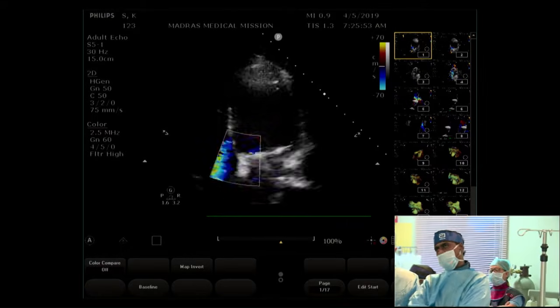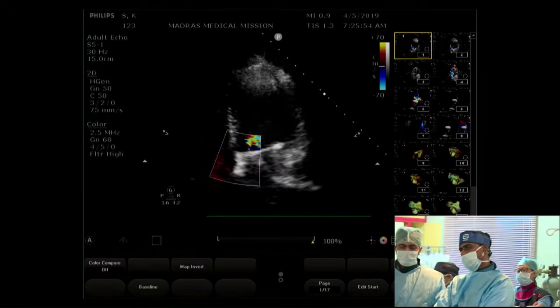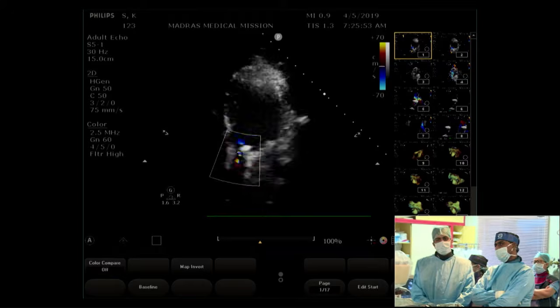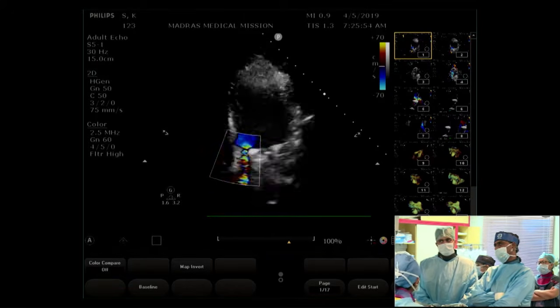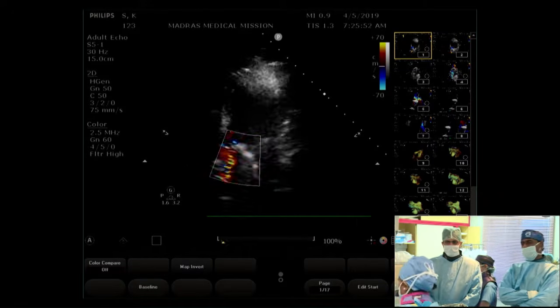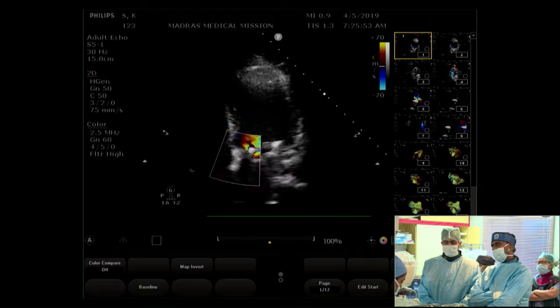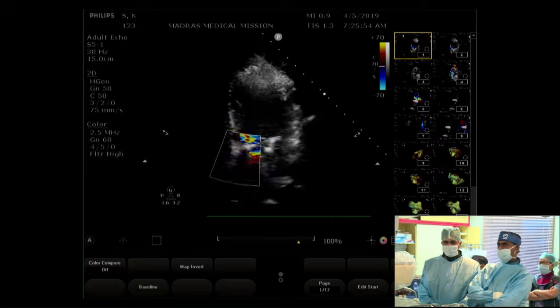There can be an option of doing a transseptal puncture and using a deflectable sheath like the Agilis sheath or the Fustar sheath, which are deflectable. However, the distance between the septal puncture and the place where we are entering the mitral paravalvular leak will be very close, and so it will be tough to manipulate the sheath at that level. So our preference for an anteromedial leak, or a leak that is very close to the interatrial septum, has been an apical puncture.